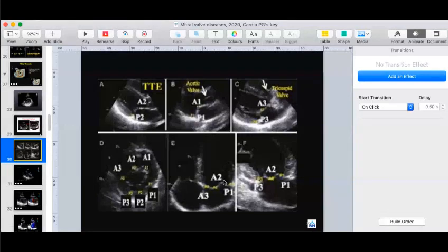So in the apical four-chamber view, you're always going to see A2, P2. So this, I think you can ignore. It can be confusing. So again, I will just say it is going to be A2, P2 here. Now the third view, which is of importance, is the commissural view. So what are the segments seen in the commissural view? You see three parts of the leaflet. So this is the two-chamber view here, and you have the anterior wall and the inferior wall here. So towards the anterior wall, you have the P1 here.